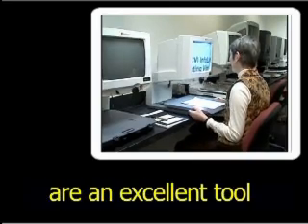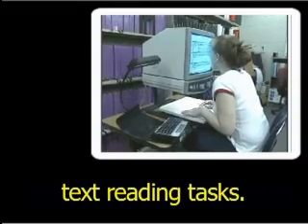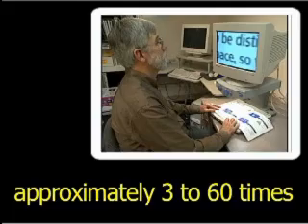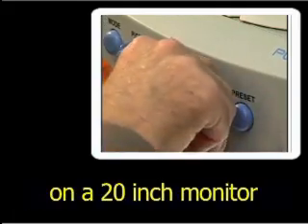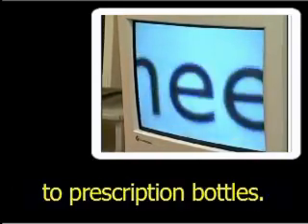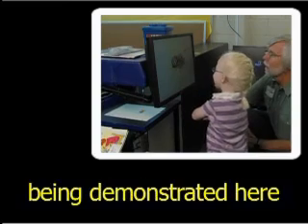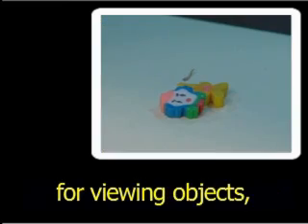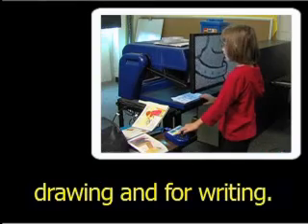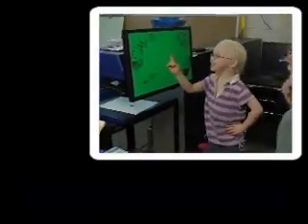Desktop video magnifiers are an excellent tool for lengthy, continuous text reading tasks. The unit can magnify an image from approximately 3 to 60 times on a 20-inch monitor, and facilitate reading everything from books and newspapers to prescription bottles. Desktop video magnifiers are also useful for viewing objects, completing handcrafts, drawing, and for writing. Two young girls operate the magnifier with ease.